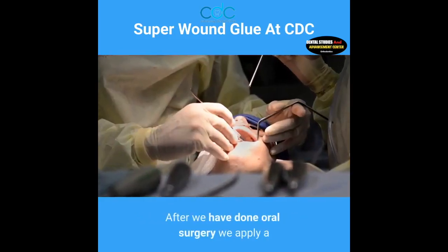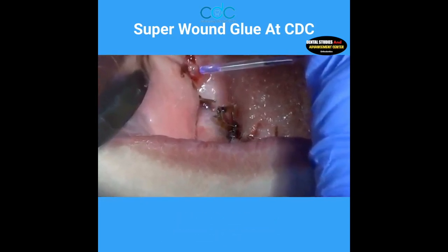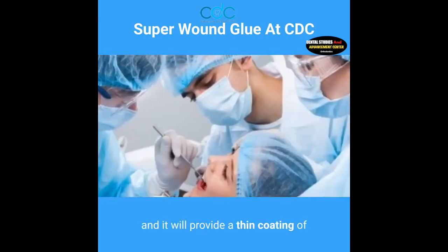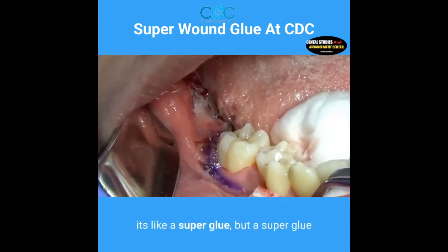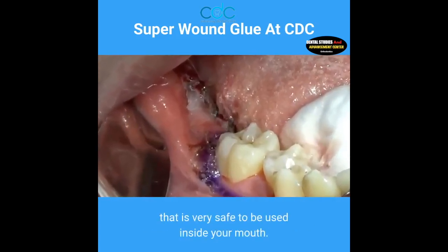After we have done oral surgery, we apply a smooth liquid film to the lacerated area or cut. The applied liquid bandage will dry in approximately 30 seconds and it will provide a thin coating of hardened liquid violet material on top of the cut. It's like a super glue, but a super glue that is very safe to be used inside your mouth.